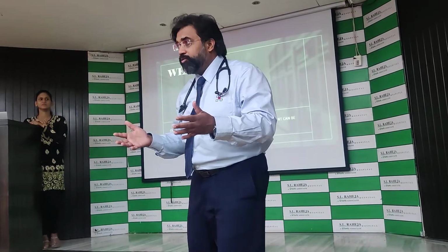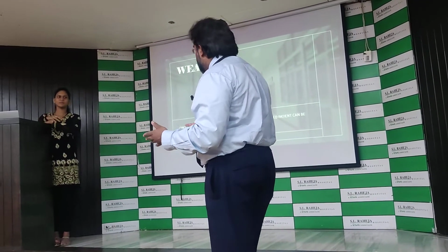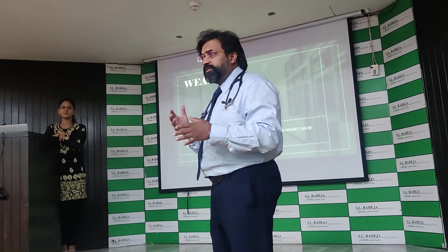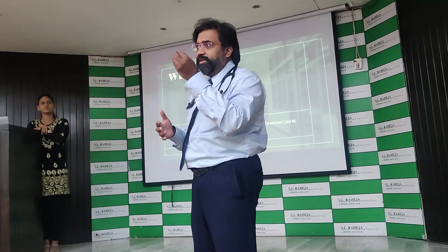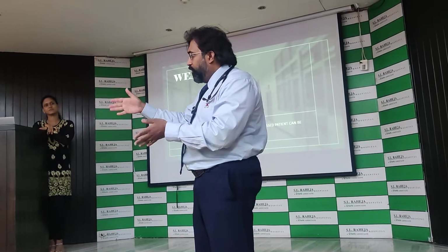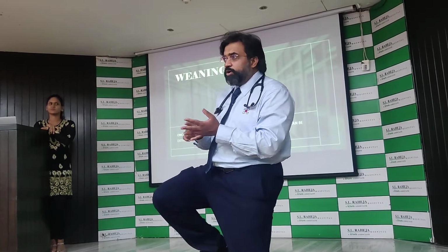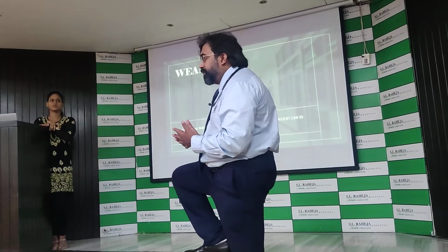Otherwise, it's asynchrony. Say if you're in volume control and this patient starts breathing, what is going to happen? If the volume control patient starts breathing, every breath will be assisted with the full volume. So if the patient is breathing at 10, you will get 10 breaths. If you have set 10 and he breathes 20, you will still get 20 full breaths on assist control. So his minute ventilation will go up, his volumes will go up. He will on the whole become asynchronous.